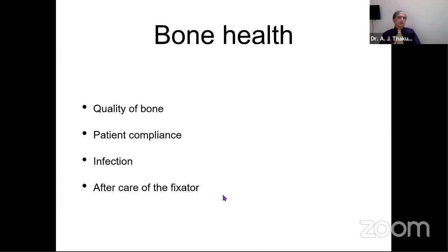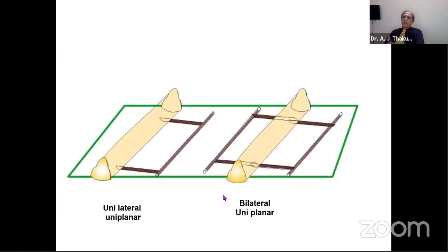Engineers are aware of how it happens, so they would take care of it, but we should also learn that when left alone, the fixator may become loose. So one should occasionally tighten the nuts and all the parts so that it is maintained. Aftercare of the fixator is also important. So with this, what can we create? We can create different frames, and we have got good names for them.